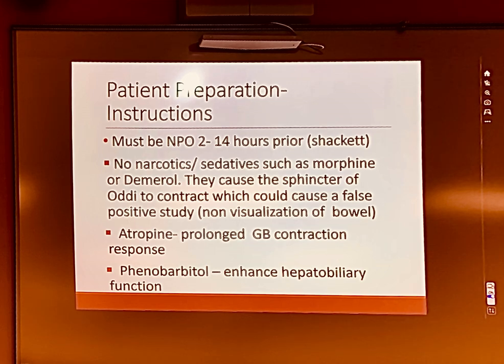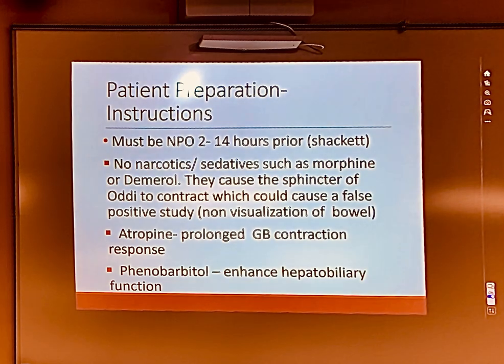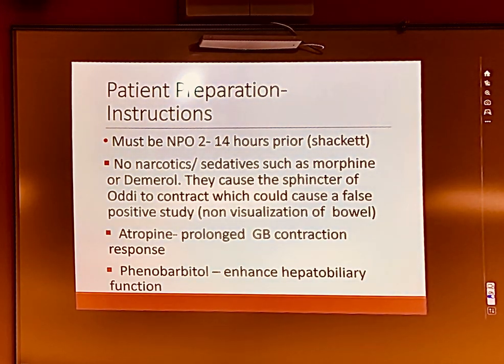So it's either going to give you a false positive study, or if it was open, a false negative study. Okay. Usually it contracts and stays that way, so typically it's a false positive because your bowel never shows up. The reason the bowel never shows up is because you have now done a pharmacological obstruction.